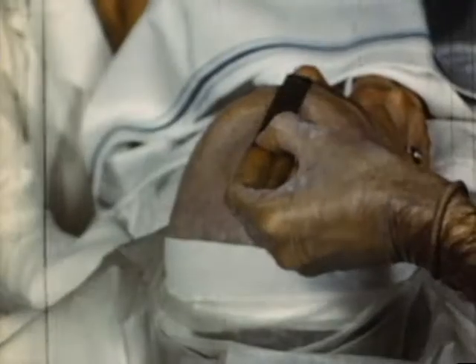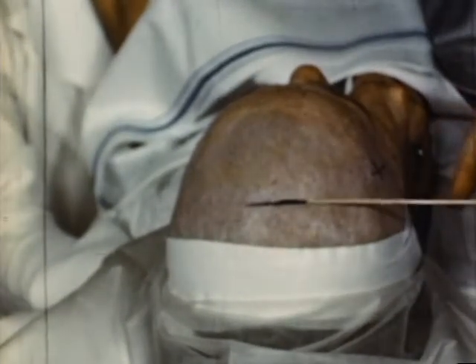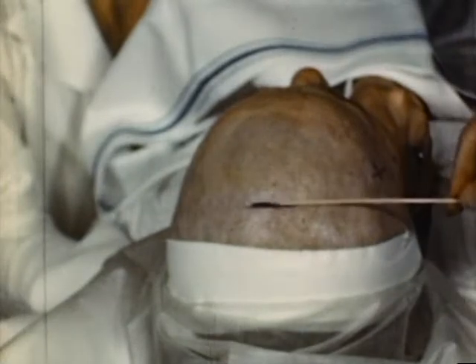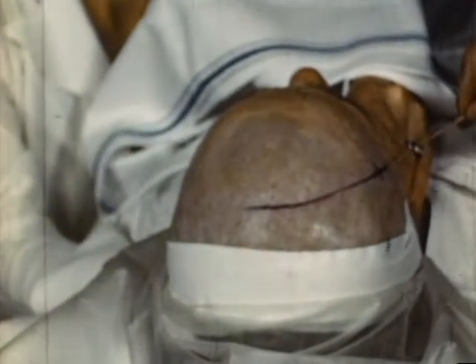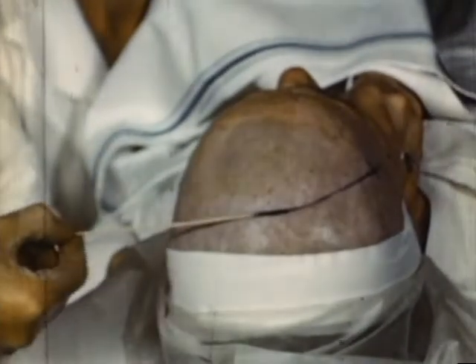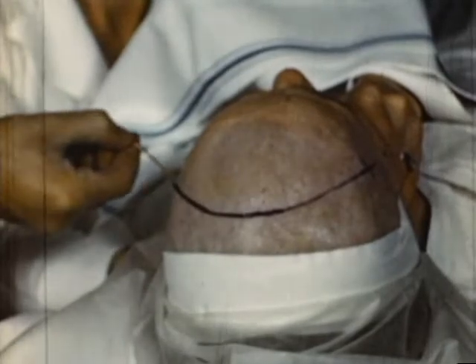Another mark is made in the midline, 13 centimeters from the glabella. These points are joined by a line leading over the vertex, following as accurately as possible the coronal suture. The midline is similarly indicated.